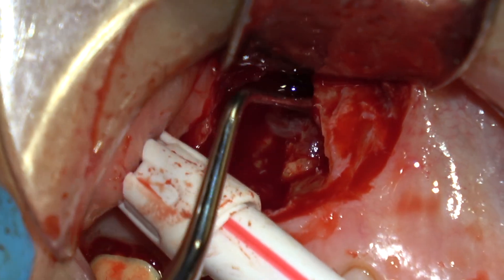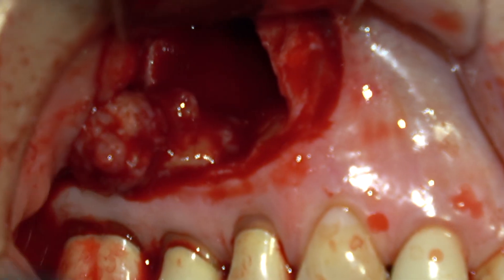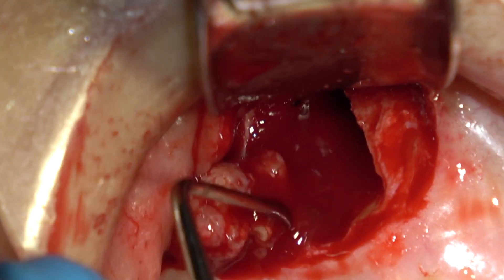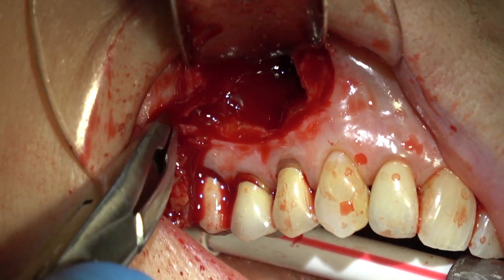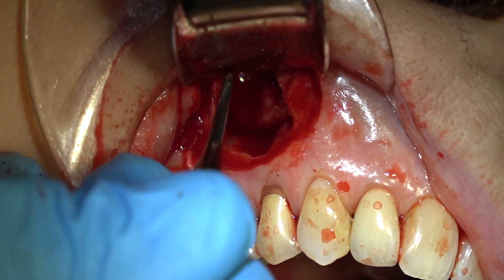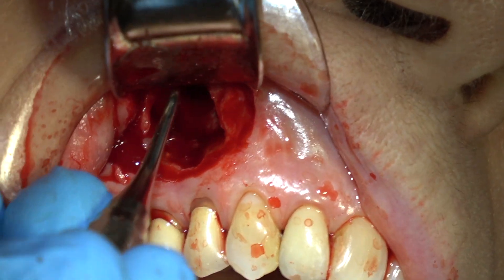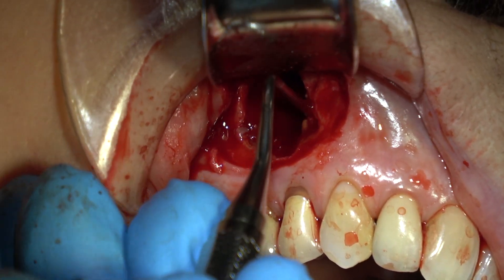Of course, if these teeth had not had endodontics, you want to perform endodontics on the teeth. I'm curating all of that granulation tissue and infection out of the socket — it'll just peel right out. See, I've got good access behind the roots because I've flattened them out.